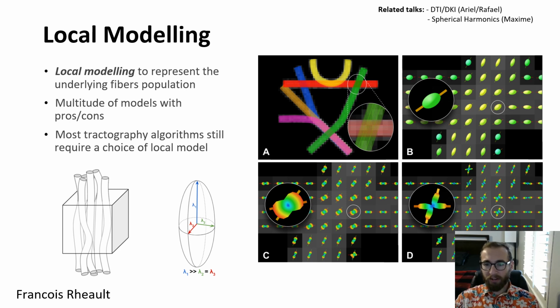If you have a simple model like DTI, diffusion tensor imaging, you end up representing the straight line and the crossing as a single object, like a sphere or a small ellipsoid like this. In the straight line, the ellipsoid is quite good. The ellipsoid represents the average orientation, but when you reach the crossing, you end up with a 45-degree angle that is basically wrong for both pathways.